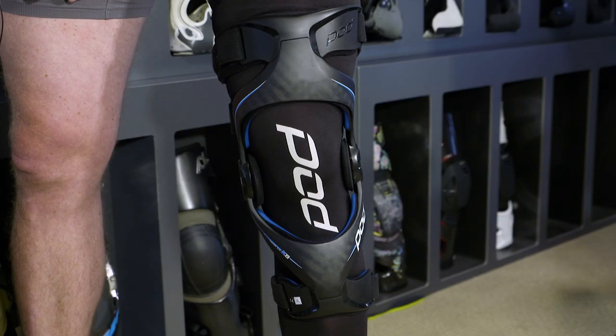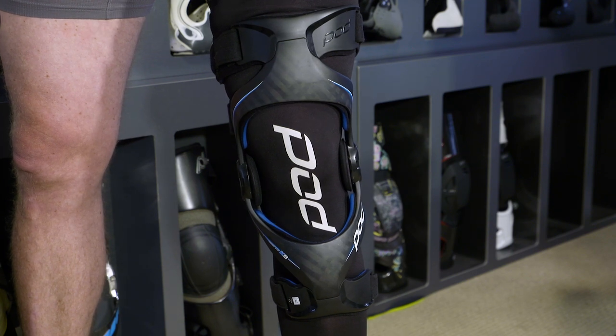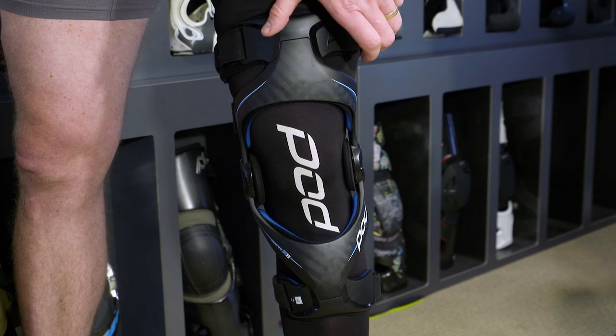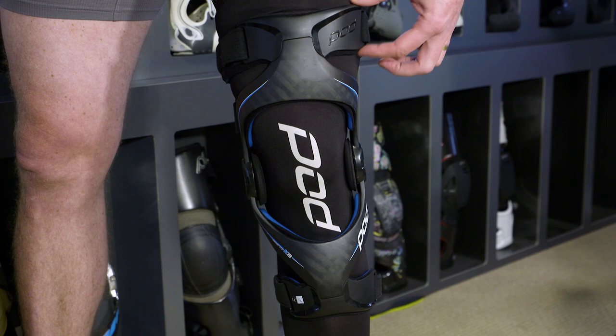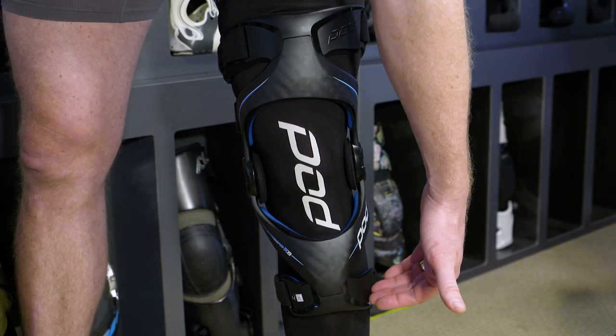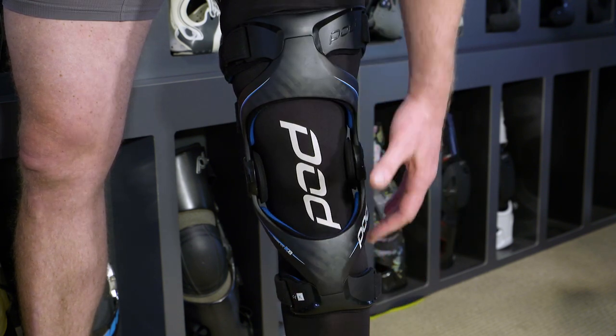Now that we've fitted the brace sitting down, as you stand up you can see how the brace is supposed to fit the leg. One of the key benefits is the adaptive cuffs — they provide a custom fit. Strap number three and the cuff fits perfectly around the thigh, and down on the shin bone, strap number four and the adaptive cuff work perfectly.